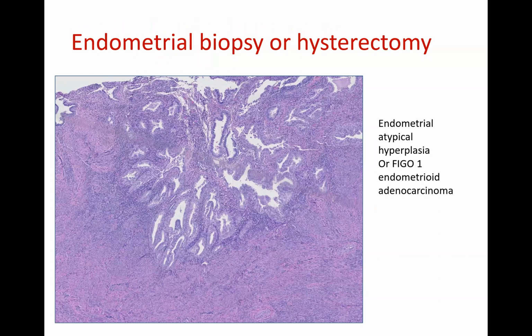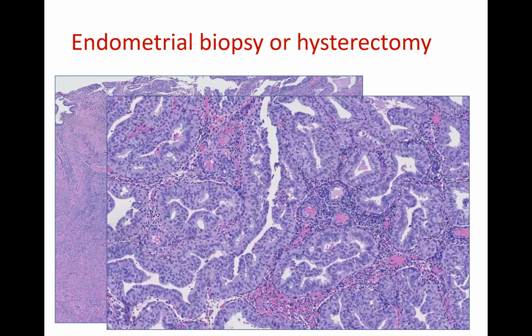Granulosa cell tumors are estrogenic. So this patient has high estrogen levels. And what do you expect is happening in the endometrium? Of course, the endometrium has atypical hyperplasia or even adenocarcinoma. And that is why this patient had abnormal bleeding. You can see how this case can be very scary on frozen section because you are presented with a large hemorrhagic tumor and the surgeon is telling you, oh, this is cancer, it grows fast and the patient has bleeding. Well, again, yes, I know why she has bleeding. She has high estrogen and she has atypical endometrial hyperplasia.